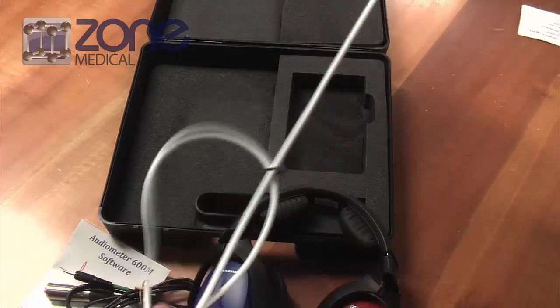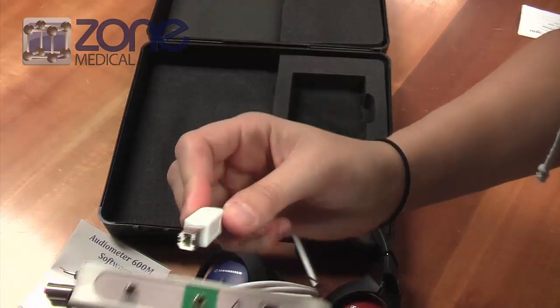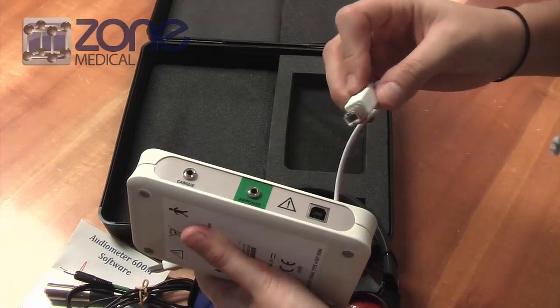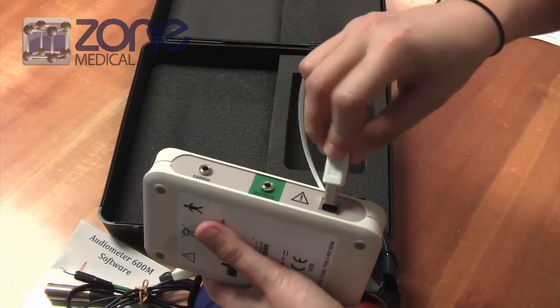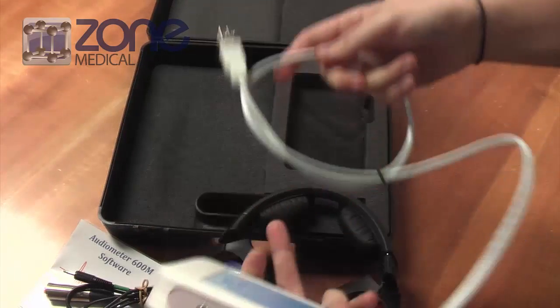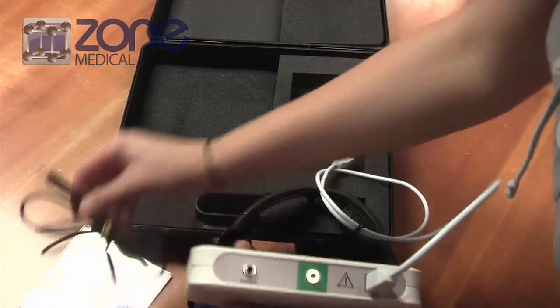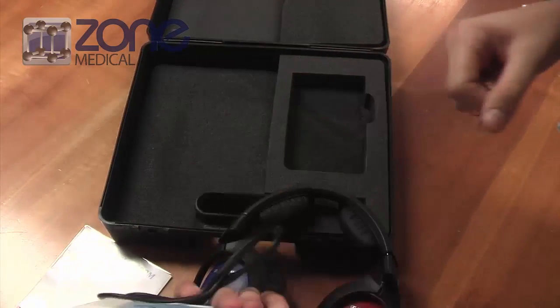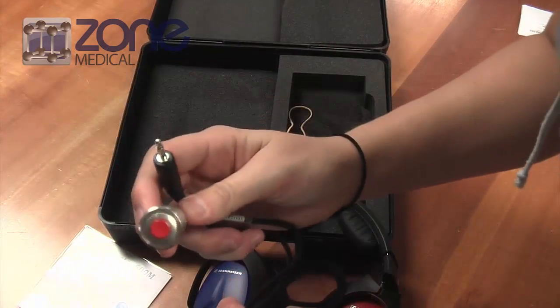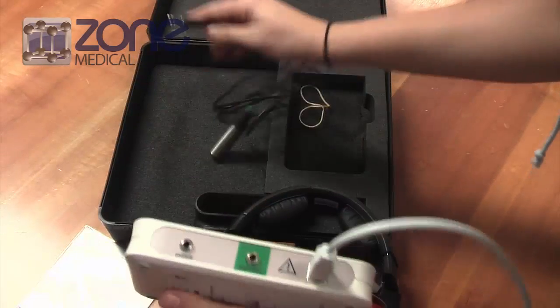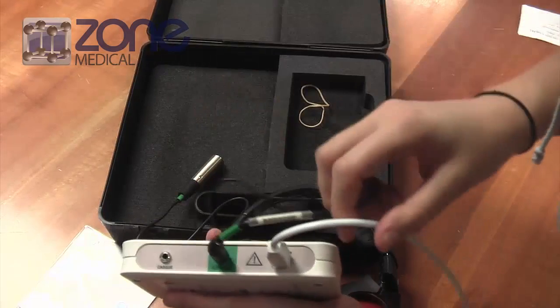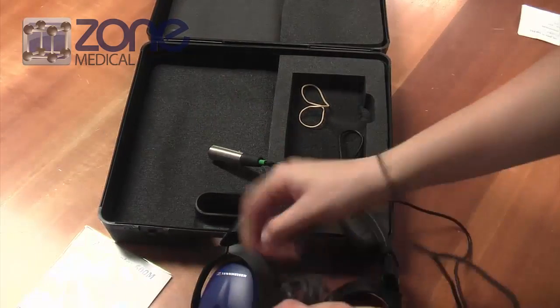The USB provides power to the audiometer, so as soon as it's plugged into the computer it'll automatically power up. Next, plug in the patient response switch, which has green around it to make it easier, and finally connect the headphones.